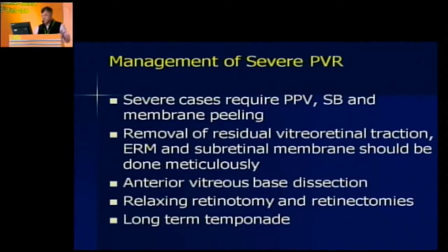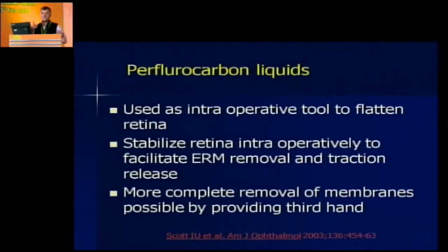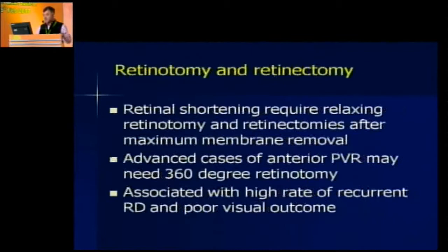And most of the time you require a perfluorocarbon as a third hand here. So this would help you to partly flatten the retina. You can remove these membranes and stabilize it behind. And that is how you keep on going.